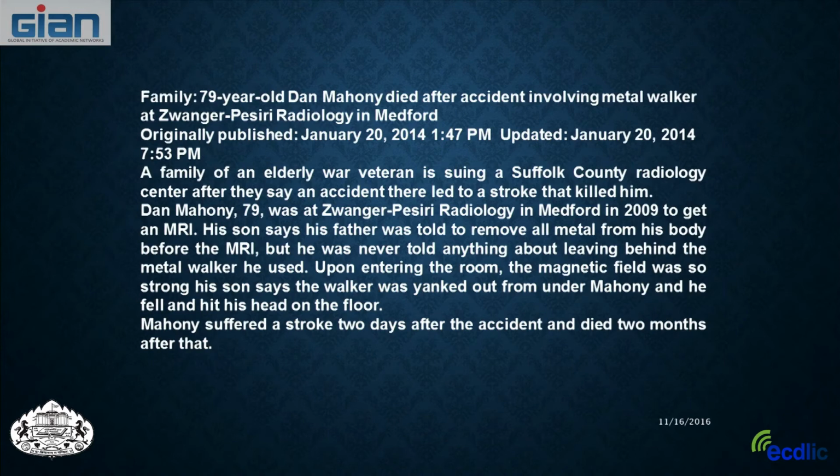Okay, this is a case of an elderly man. He went in to have an MRI scan. His son says his father was told to remove all metal from his body before the MRI, but he was never told anything about leaving behind the metal walker that he used. So when he entered the room, the metal walker was ripped out of his hands and pulled into the bore, and he fell and hit his head on the floor. He suffered a stroke from this accident 2 days later, and he died 2 months after that.